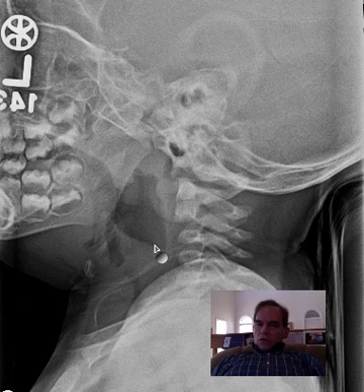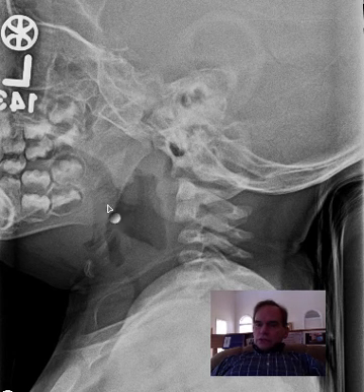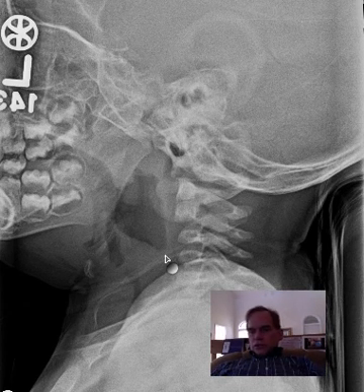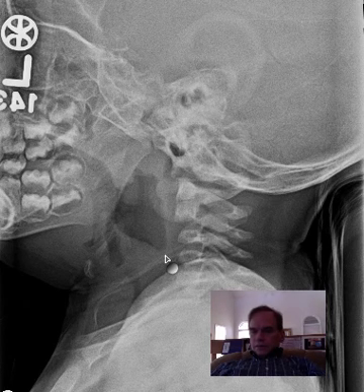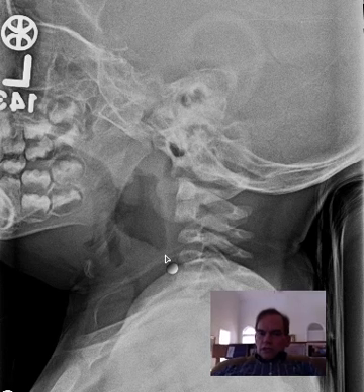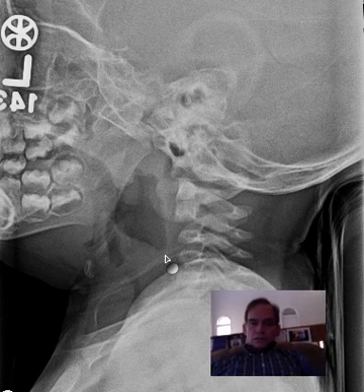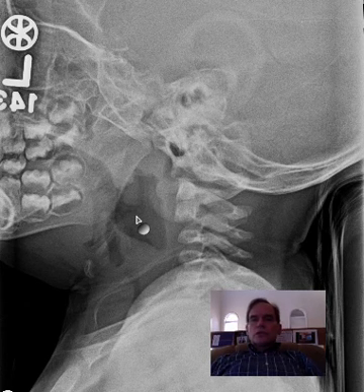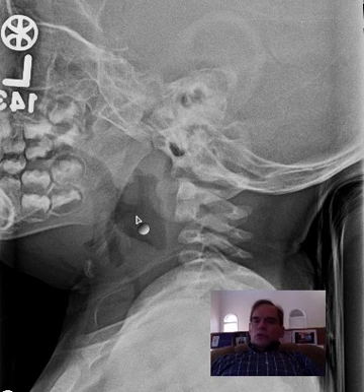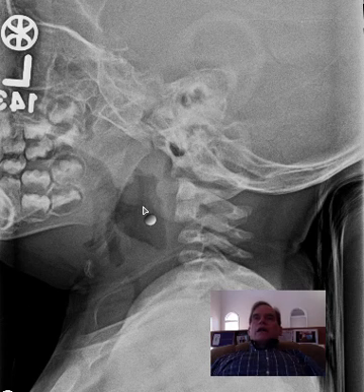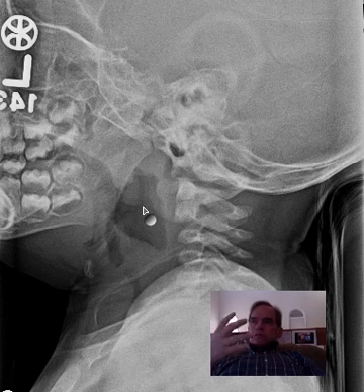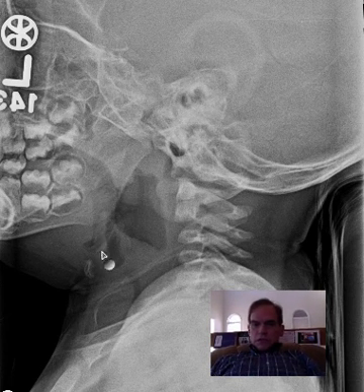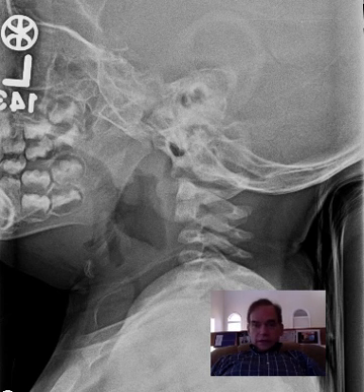This is croup, and we also get hypopharyngeal distension as you see back here. Some people have the mistaken impression that this has to do with the amount of pressure building up in the back of the mouth. No — the mouth is open, so all parts freely communicating with the mouth are at the same pressure. This is just because the child is trying to reduce the resistance of the posterior oropharyngeal airway, taking a big breath and trying to distend their mouth and posterior oral cavity as much as possible to diminish resistance so they can get air into their lungs.